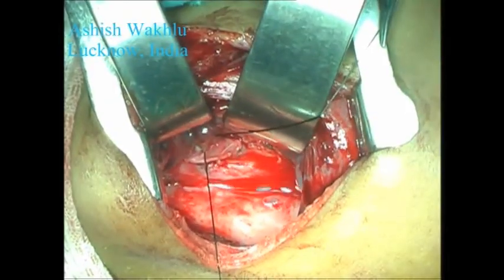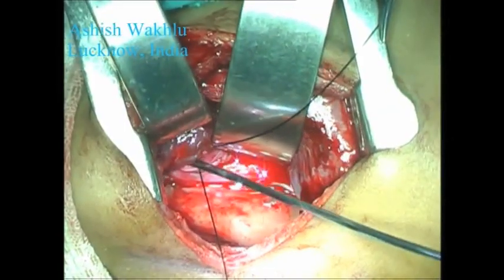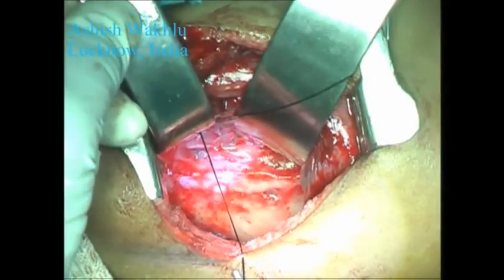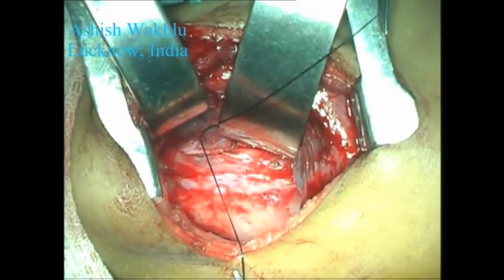The lumen of the bronchial bifurcation being tested on both sides, and one can see mucoid secretions flowing freely from the till now collapsed lung.